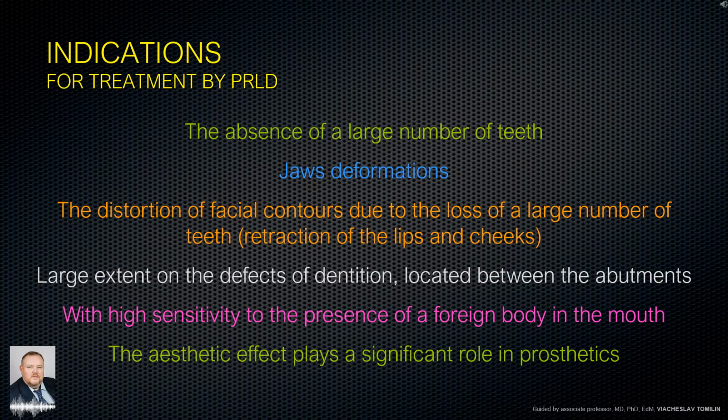Large extent of the defects of dentition, located between the abutments. With high sensitivity to the presence of a foreign body in the mouth, with a total nervous disorder, adaptation to PRLD is longer. The aesthetic effect plays a significant part in prosthetics; preference is given to the prosthesis that less catches the eyes.